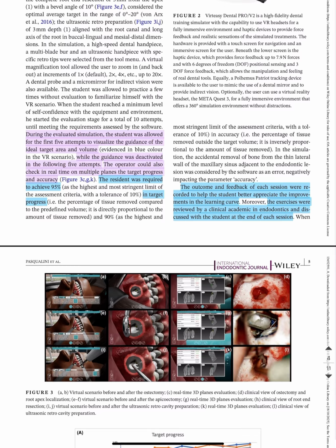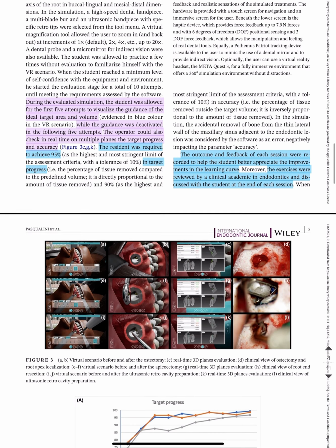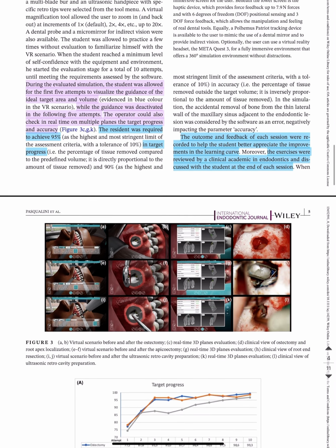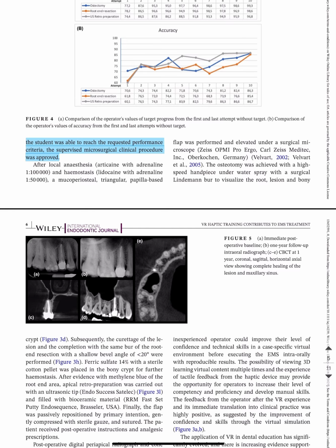The operator could also check in real time, on multiple planes, the target progress and accuracy. The resident was required to achieve 95% progress in the targeted area. The outcome and the feedback of each session were recorded to help the student better appreciate the improvements in the learning curve. Moreover, the exercises were reviewed by a clinical academic in endodontics and discussed with the student at the end of each session. The student was able to reach the requested performance criteria and the supervised microsurgical clinical procedure was approved.